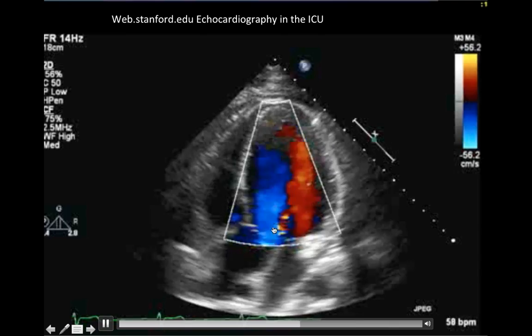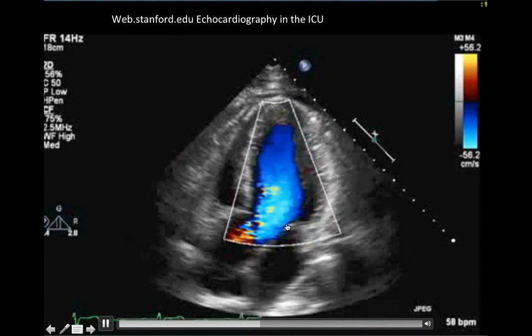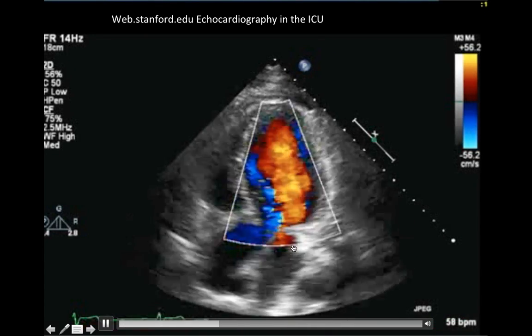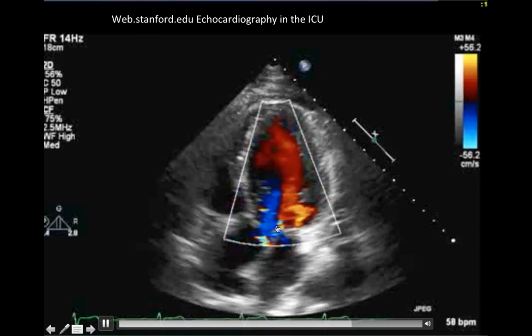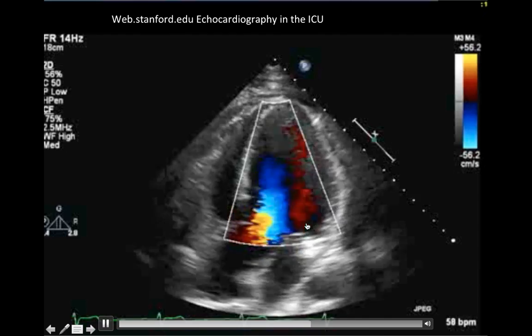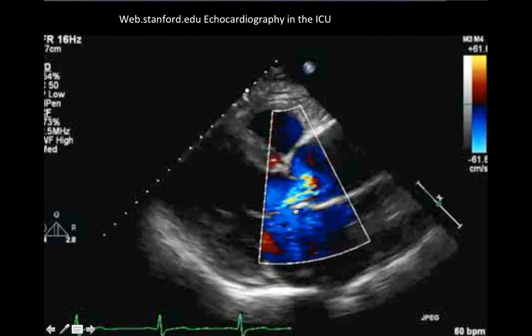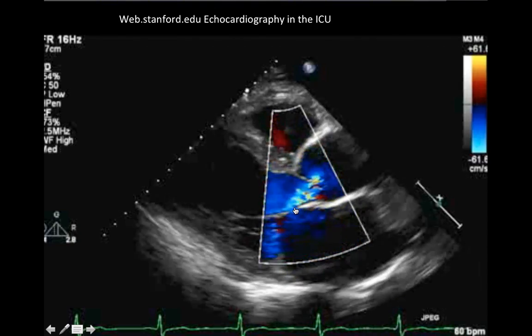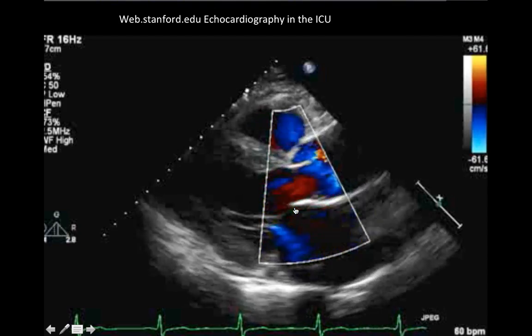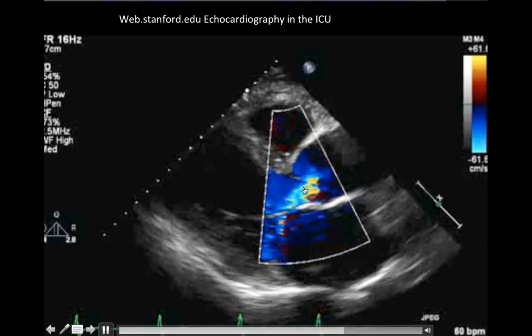Coming through, coming through. You have blood coming through this mitral valve, which can kind of confound things. So that's why you have to look very carefully for a jet, a narrowed portion, like a flame. You can compare with the parasternal long axis view with color flow. Here you can see during diastole a strong jet moving past the aortic valve back into the left ventricle.